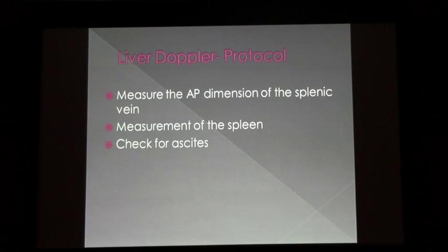Whether it's big or small, it doesn't make any difference. The velocity is going to be more important because it's there along with the waveform as well as the direction of flow. So remember, veins are a capacitance system, right? That means they're there to expand and contract in relationship to volume or to other stressor states that are going on in there.